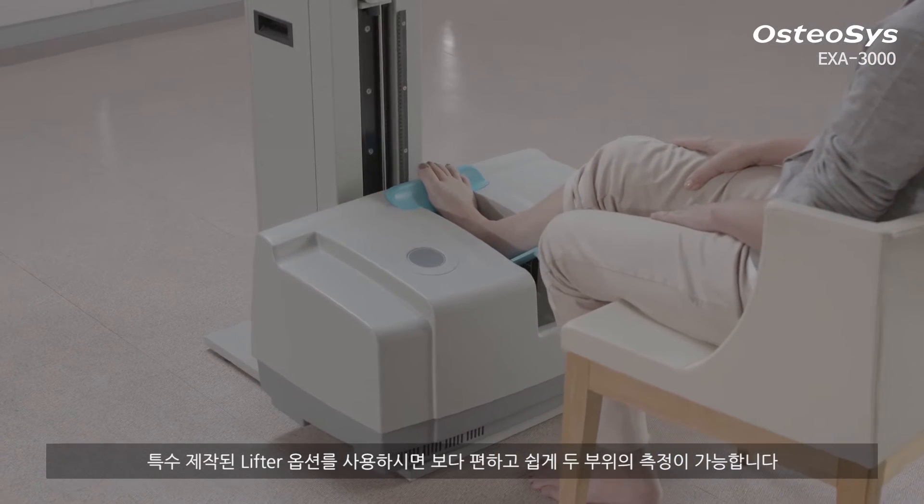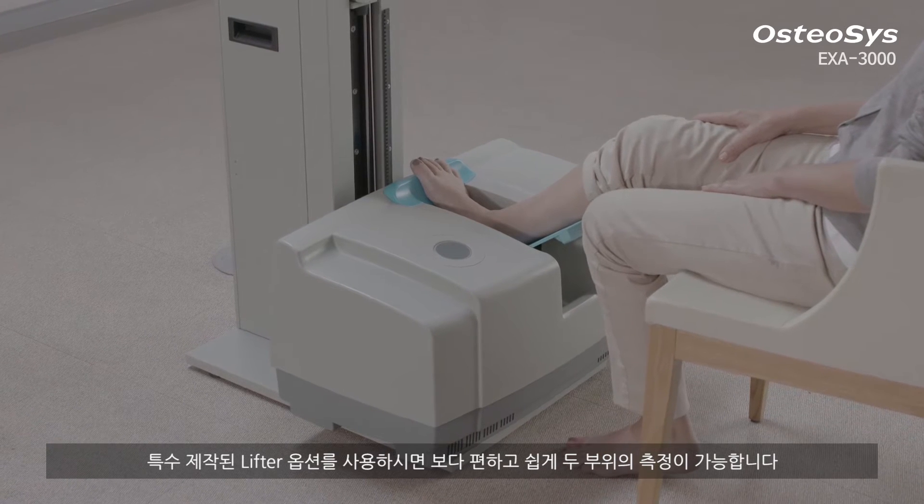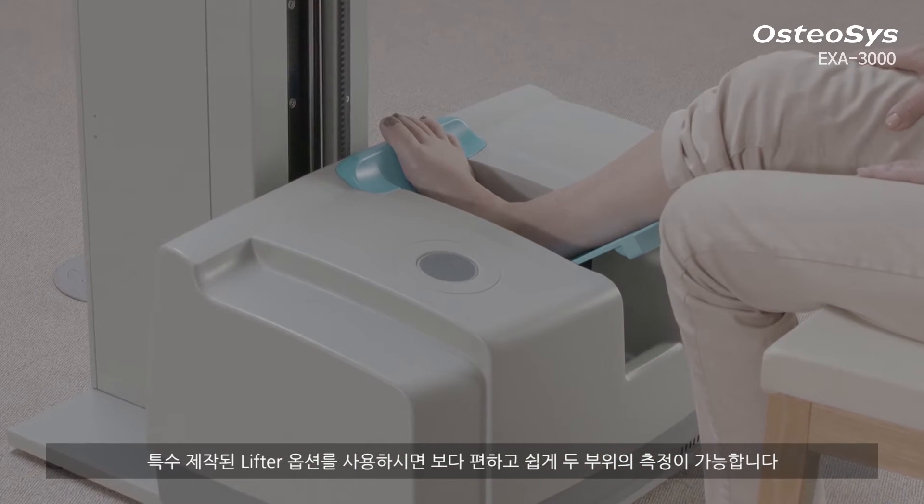If you utilize the lifter, which is an optimal item for easier lifting up and down of the device, you can measure those two areas more conveniently.